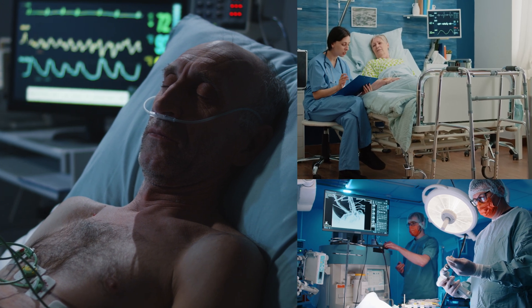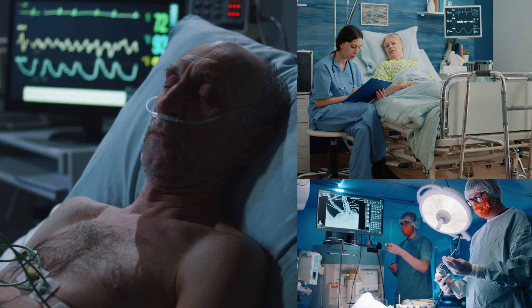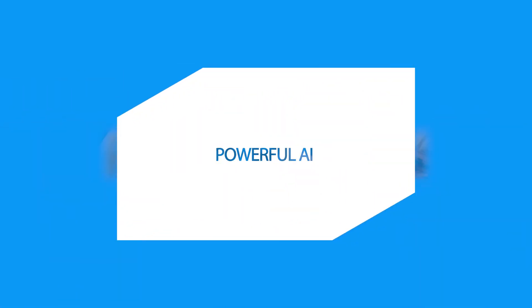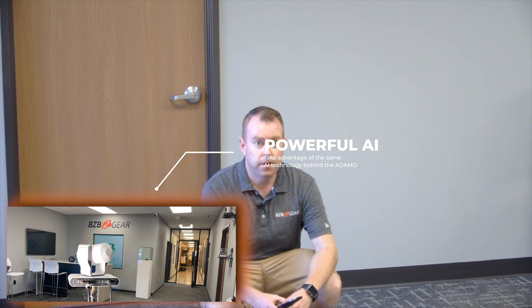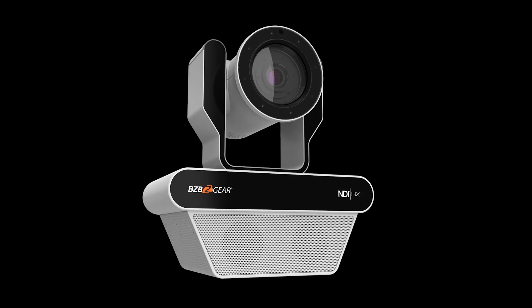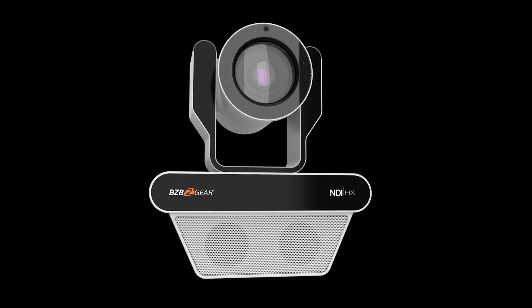On top of all these features, the Nutrix comes with one special ace up its sleeve: AI. The Nutrix comes equipped to handle all of its duties, as well as extra ones like auto-tracking and auto-patient activity monitoring. Elevate your healthcare services with the BG Nutrix. Visit our website or contact us to learn more at bzbgear.com. BG Nutrix, where technology meets healthcare excellence.